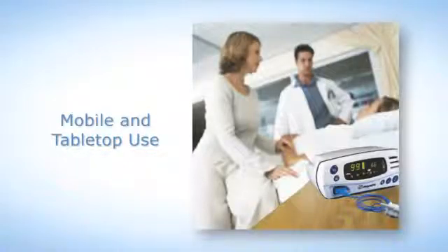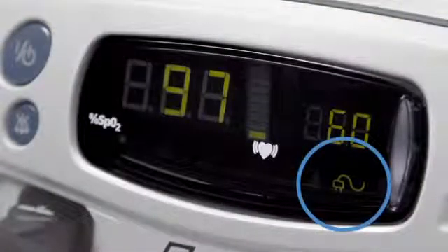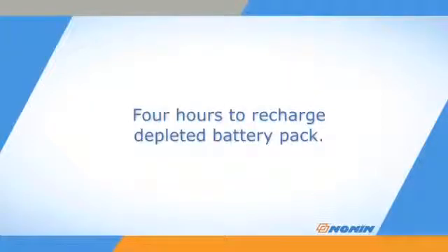The 7500 oximeter is suitable for both mobile and tabletop uses. Both can be powered by 100 to 240 volt AC wall power. A plug icon appears on the display when using external power. The oximeter can also function for at least 16 hours from a fully charged battery pack. The battery recharges when plugged in, whether running or in standby mode, and takes about 4 hours when completely depleted.